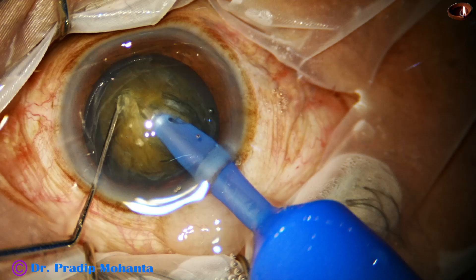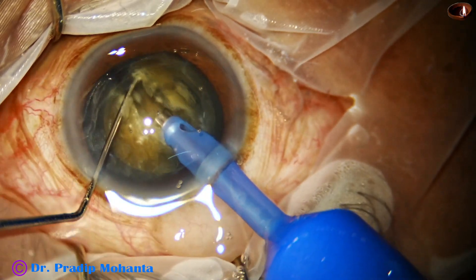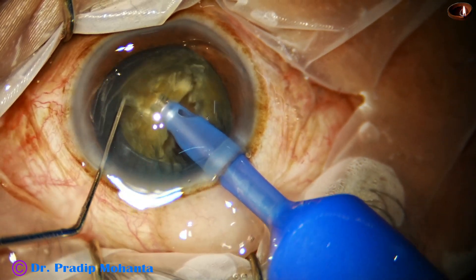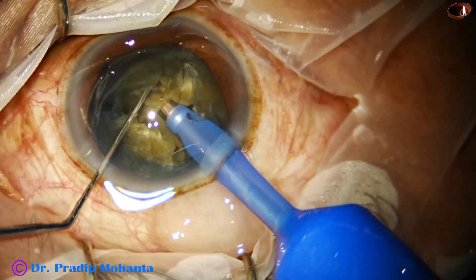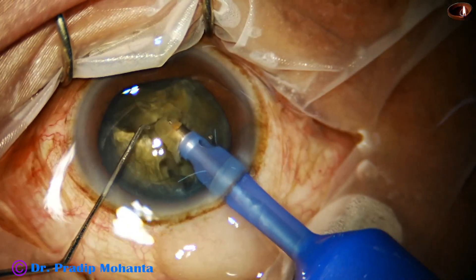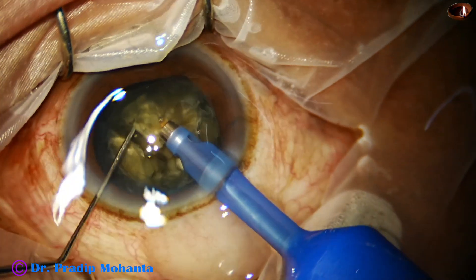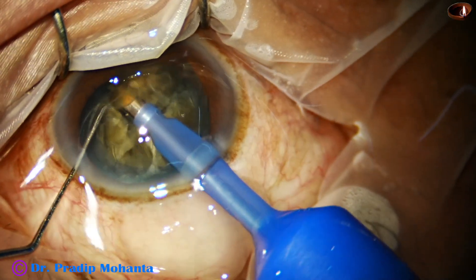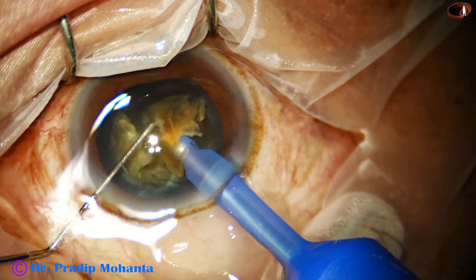The tip goes through the substance of the nucleus towards the opposite equator, and I get a crack. This crack has become thorough from one side to the other side. Now I hold one hemi-nucleus and get two pieces out of it. Then I emulsify this hard part, and now I am trying to emulsify one nuclear piece. When the ultrasonic energy is in continuous mode, the emulsification is a bit faster.